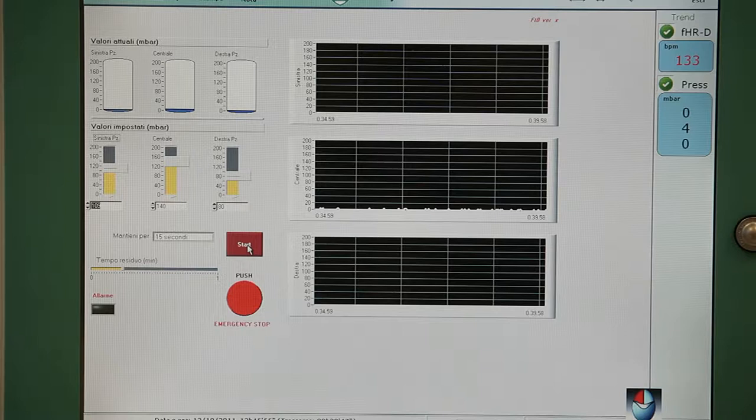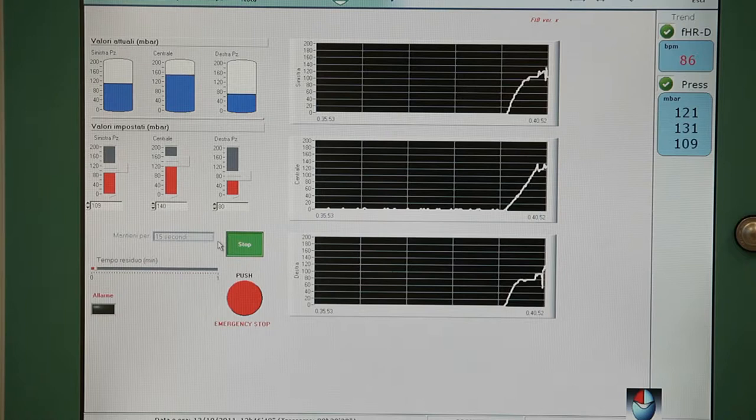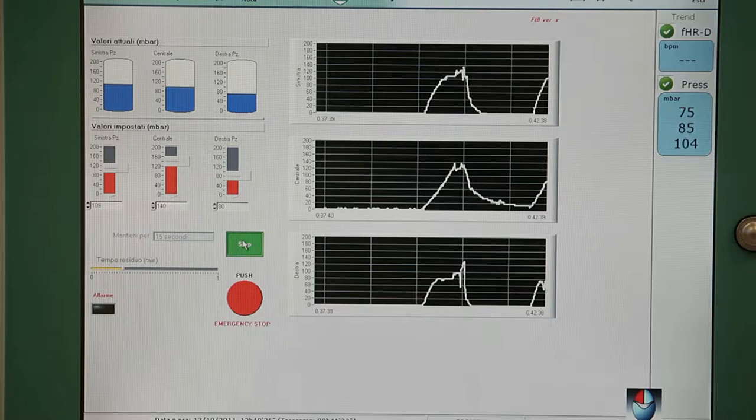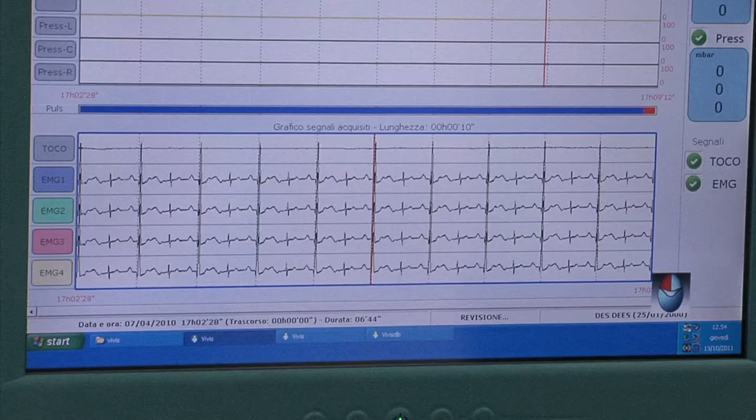Tramite un pulsante digitale viene dato lo start al gonfiaggio. Ricordiamo che il gonfiaggio è sincrono alle contrazioni uterine e ci troviamo in periodo espulsivo del travaglio di parto. Nella sezione monitoraggio compaiono i segnali bioelettrici materni e il segnale cardiaco fetale.